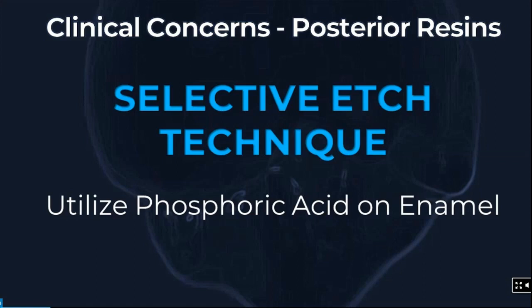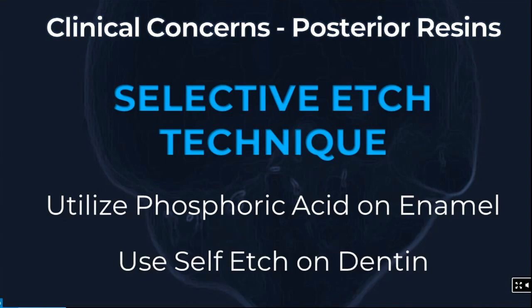A technique that I use in my practice quite a bit now is what we refer to as a selective etch technique. That is, I'm going to take advantage of using phosphoric acid on enamel, but then I'm going to use a self-etch system on the dentin.